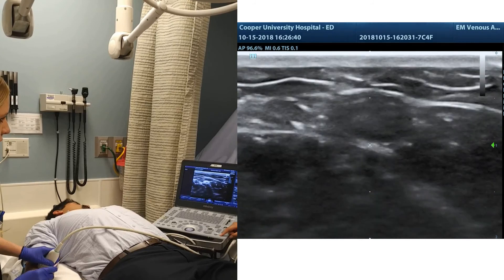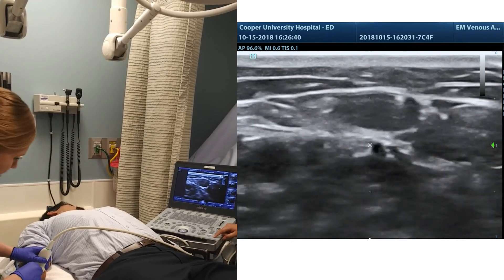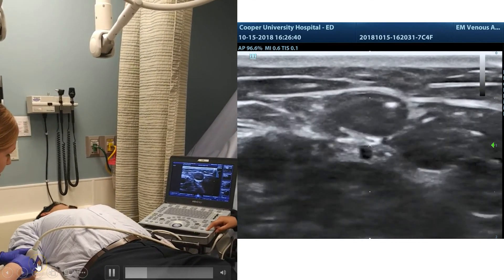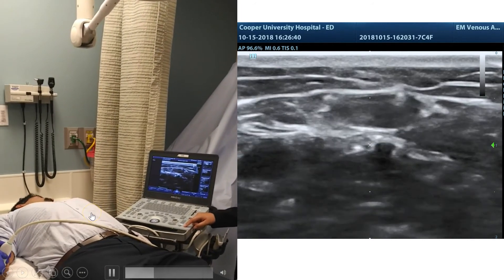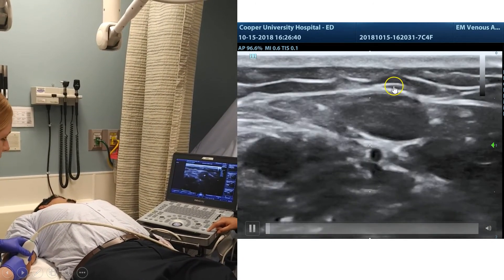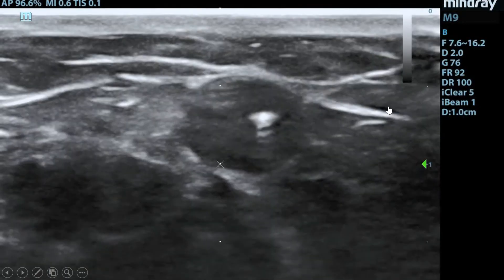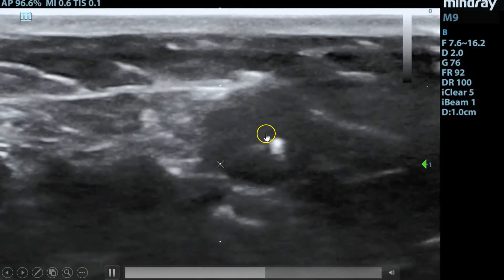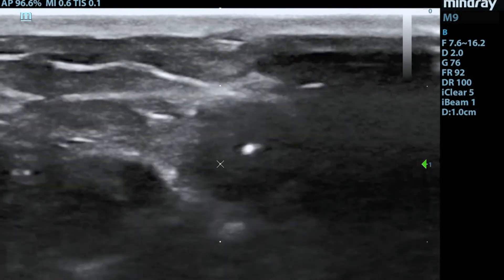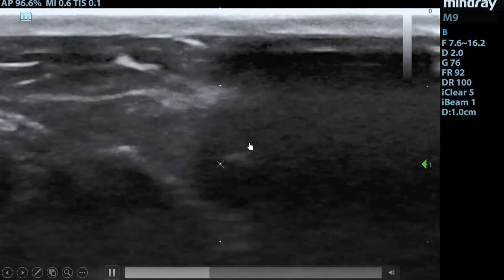In the interest of education, I volunteered to let one of our interns, Dr. Adorno, put an ultrasound-guided IV in my arm. You can see she's got the probe in her non-dominant hand, the needle in her dominant hand, and the machine across from her. She's sticking at a steep angle right behind where the probe is. You see that bright white dot come into the skin, see her advance it down towards the vessel, see her puncture into the vessel wall. Zooming in on the ultrasound portion, you see her in the vessel wall — she's sliding forward, losing sight of it, and advancing that needle, ensuring it stays right in the middle. There's a portion where she begins to lose a little bit of contact, but she gets it back, and you can see at the very end how she advances all the way in.